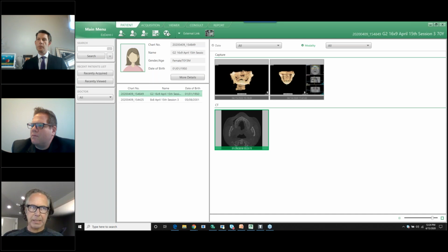So when you rush back to the practice, if you haven't started guided surgery yet, or if you are doing guided surgery, I highly recommend that whoever is doing your guides, that is your trampoline net. That's all you've got to keep you safe. You have to make sure that the person doing the merging of this data really knows what they're doing. It could be an expensive $30 that you're saving if not.